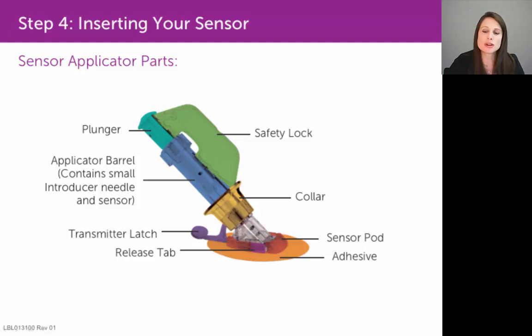At that point, you do want to insert the transmitter into your sensor pod, and you'll do that with that purple transmitter latch on the back. You want to make sure that you pick a good spot to place your sensor. If you're an adult patient over the age of 18, you can place a sensor on your abdomen.